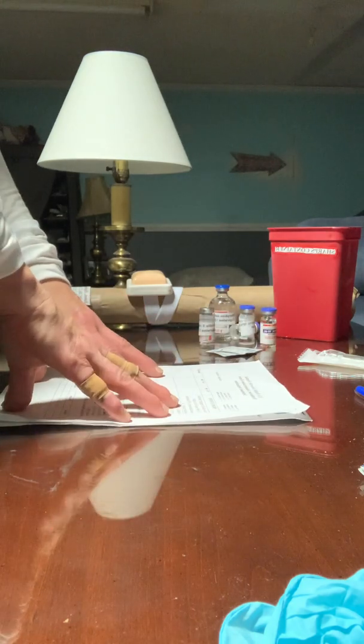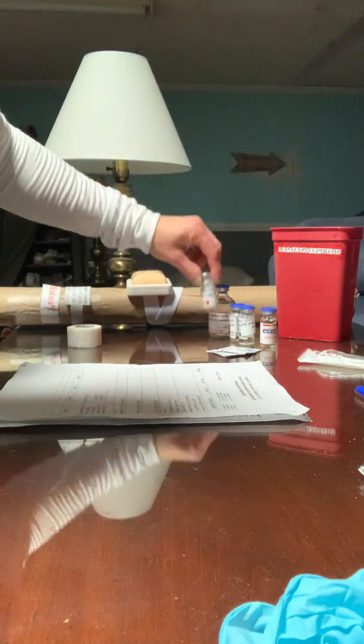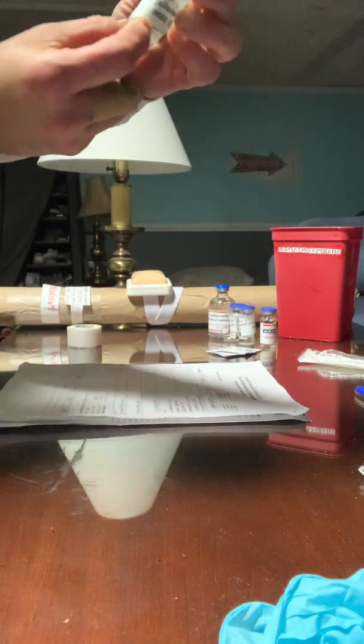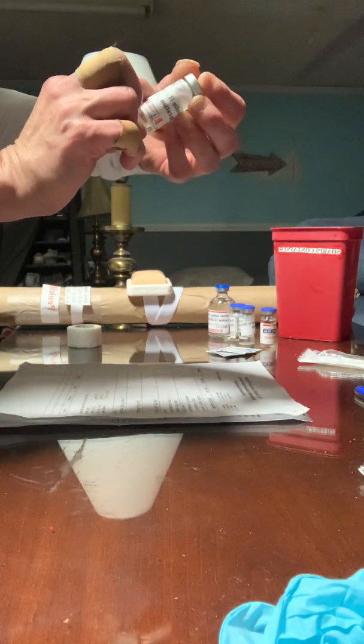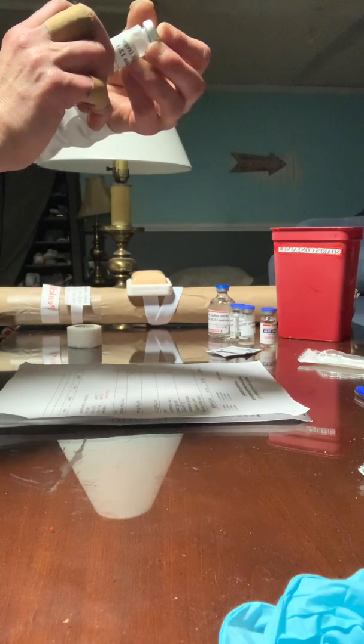Next thing I would do is take the MAR and go to prepare the medication. I would then perform hand hygiene, and this will be my first check of accuracy. I will find the correct medication, which here it is. I got Novolin R regular insulin, expiration 12/1/2025.